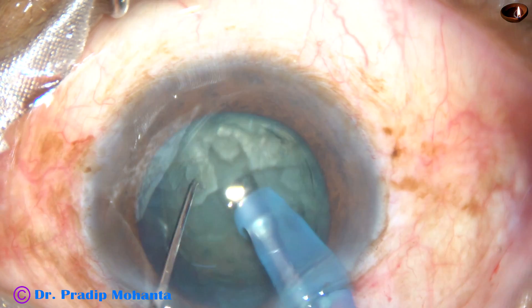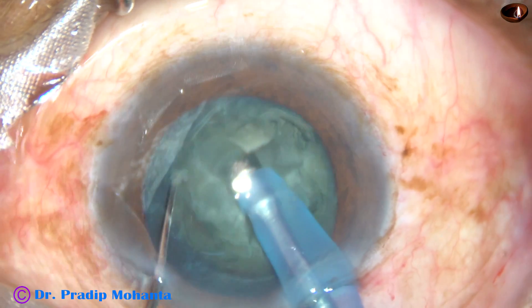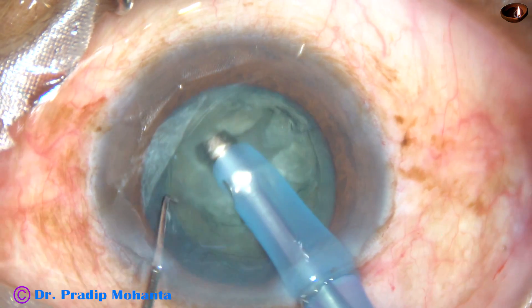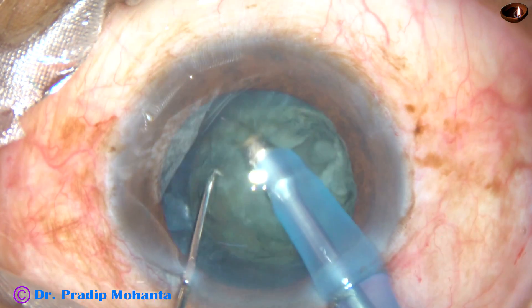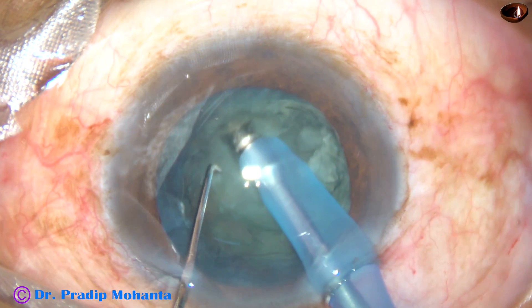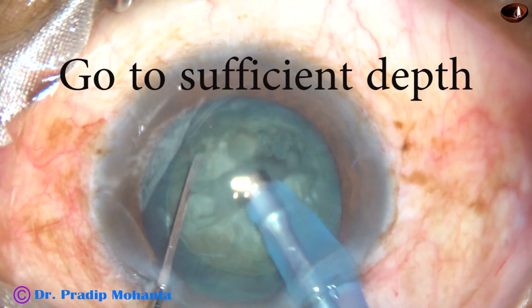Flow rate is also low, 20 to 25 ml per minute. And ultrasonic power is according to the density of the cataract. In this case, it was 50%. This is a cataract with grade 3 nucleus sclerosis. You should go really deep into the anterior chamber to sufficient depth.